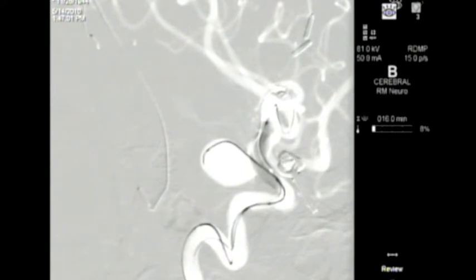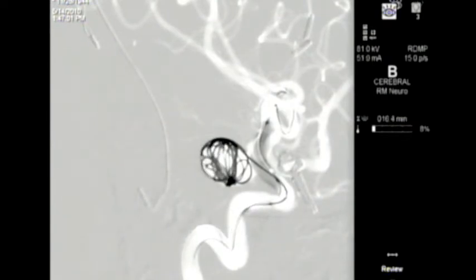Here you can see the first coil being delivered through the microcatheter into the dome of the aneurysm. This coil is made out of pure platinum. As it comes out of the microcatheter, it takes on a three-dimensional form, in essence forming a three-dimensional basket and framing structure within the aneurysm fundus.